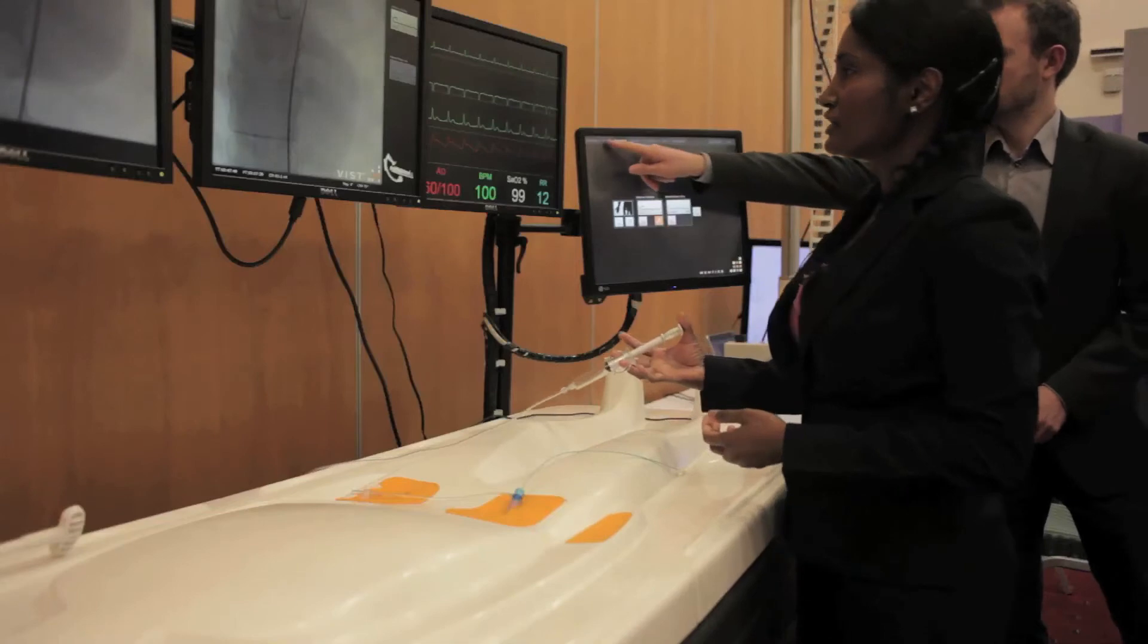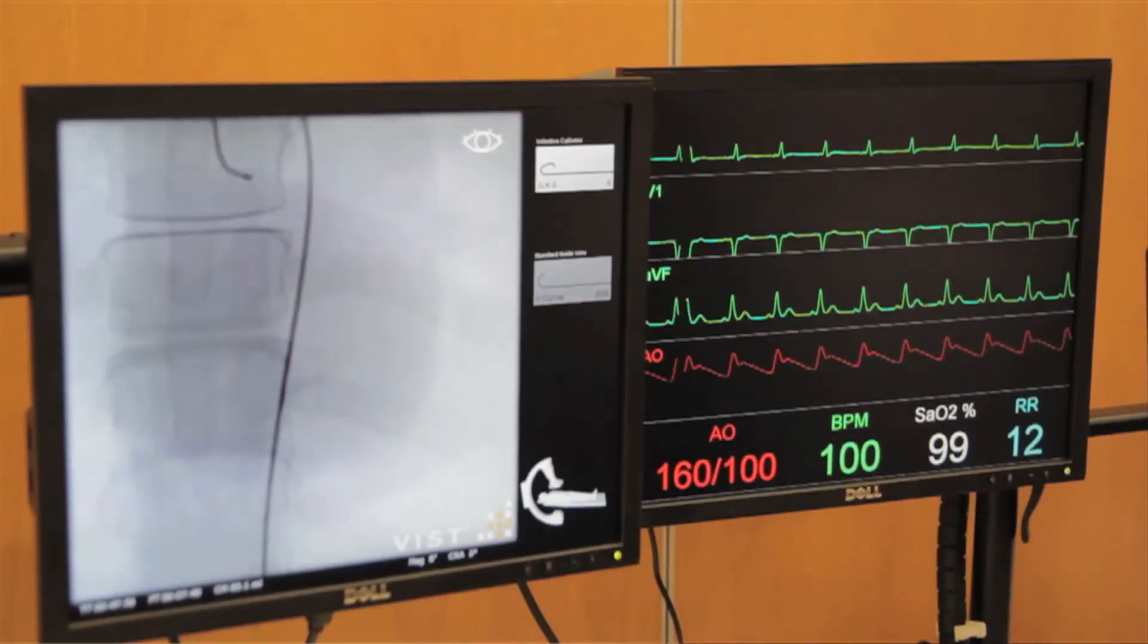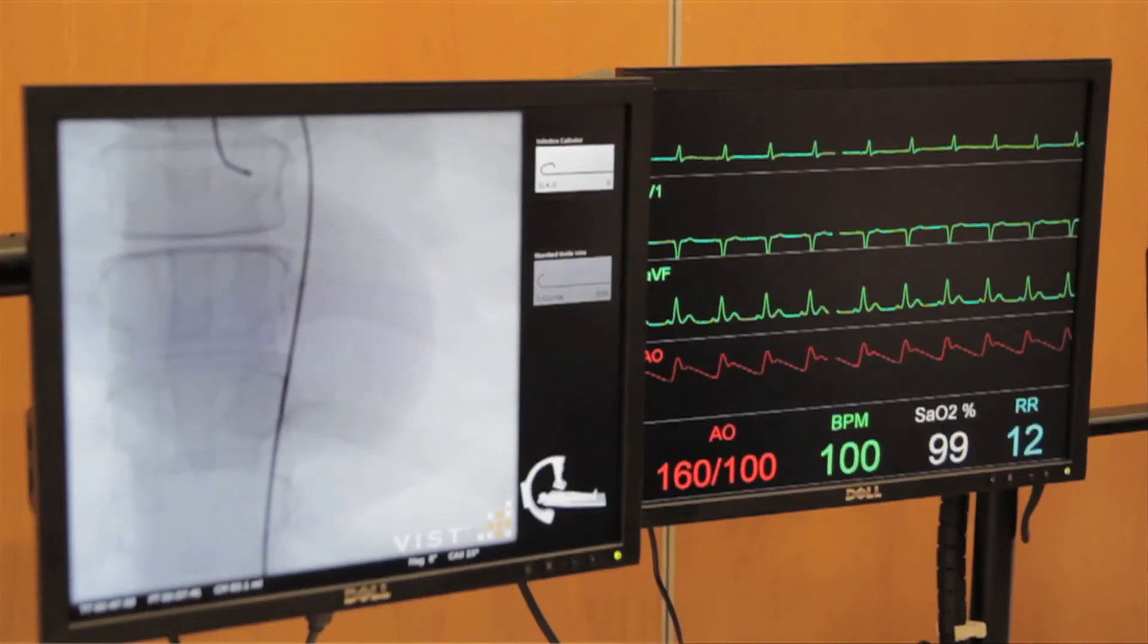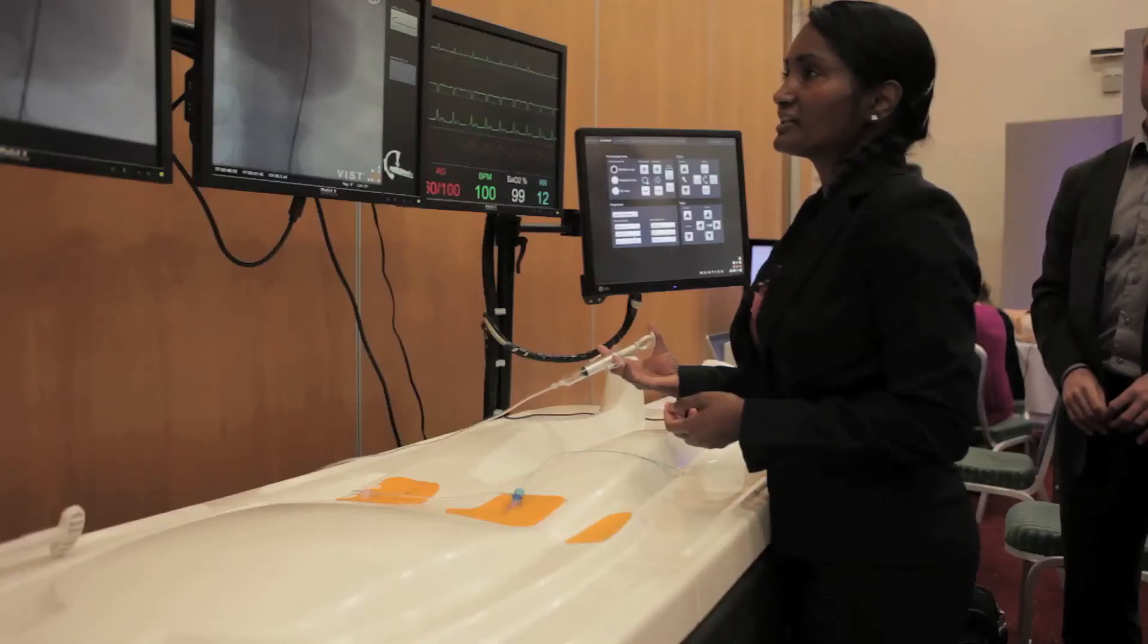So we will now go into the PA caudal view. Okay. And then we acquire. So initially you do fluoroscopy in order to ensure that the catheter has not moved.